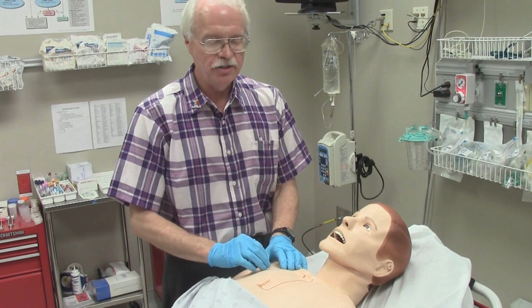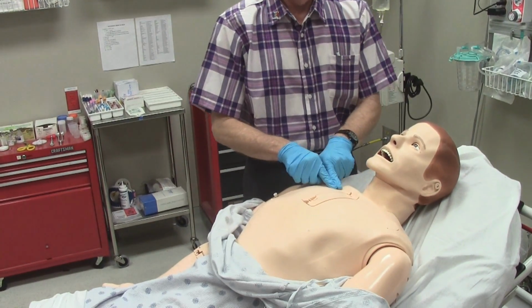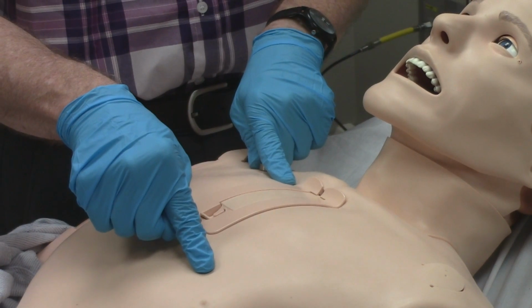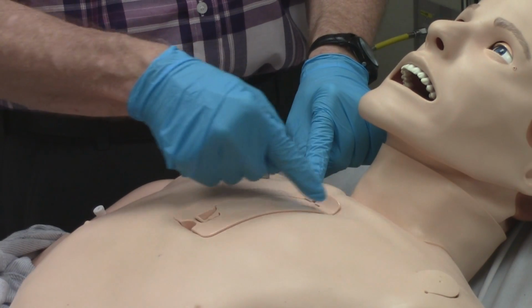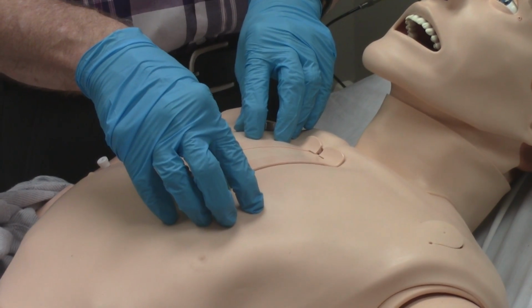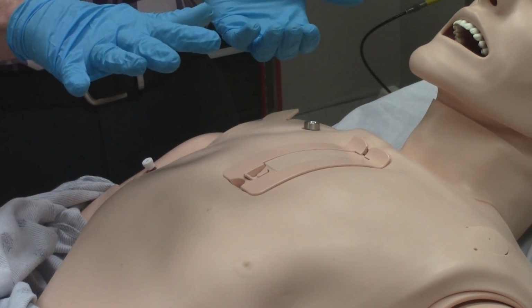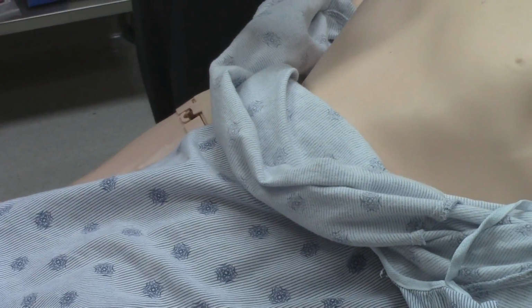SimMan has lung sounds, heart sounds, and bowel sounds. There are 4 speakers for the heart sounds that are located in the standard locations for cardiac auscultation. So there is an aortic, pulmonic, tricuspid, and mitral speaker on the chest. The mannequin also has speakers for each pulmonary lobe anteriorly and posteriorly, and there is a speaker in each abdominal quadrant for bowel sounds.